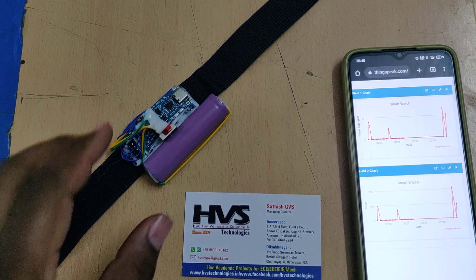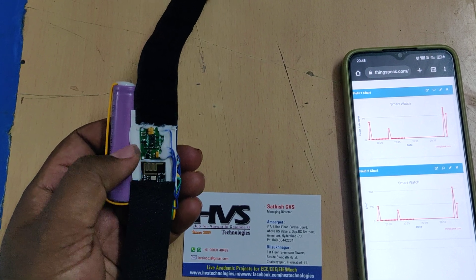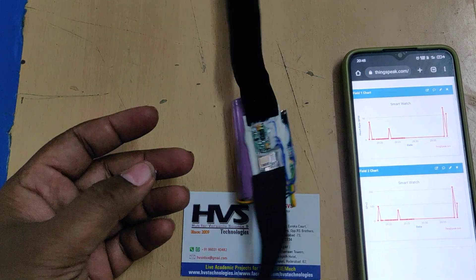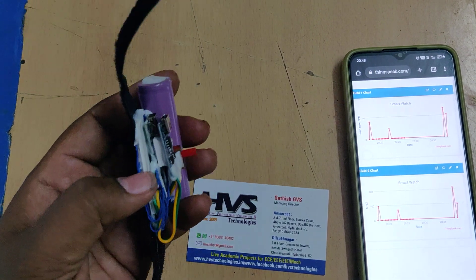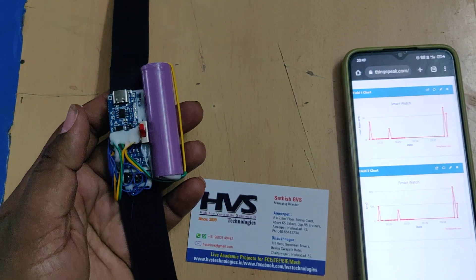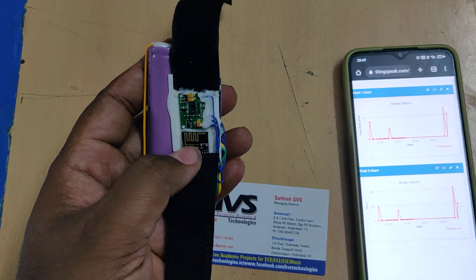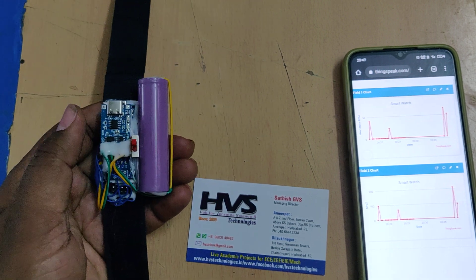These two parameters are achieved with the help of the MAX30100 sensor. This green component is the MAX30100 sensor, interfaced to the Arduino Nano board. Below the TP4056, we placed the Arduino Nano board, which is connected via the A4 and A5 pins to the MAX30100. The data is uploaded to the ThingSpeak cloud platform with the help of the ESP8266 WiFi module, connected to pins 8 and 9.